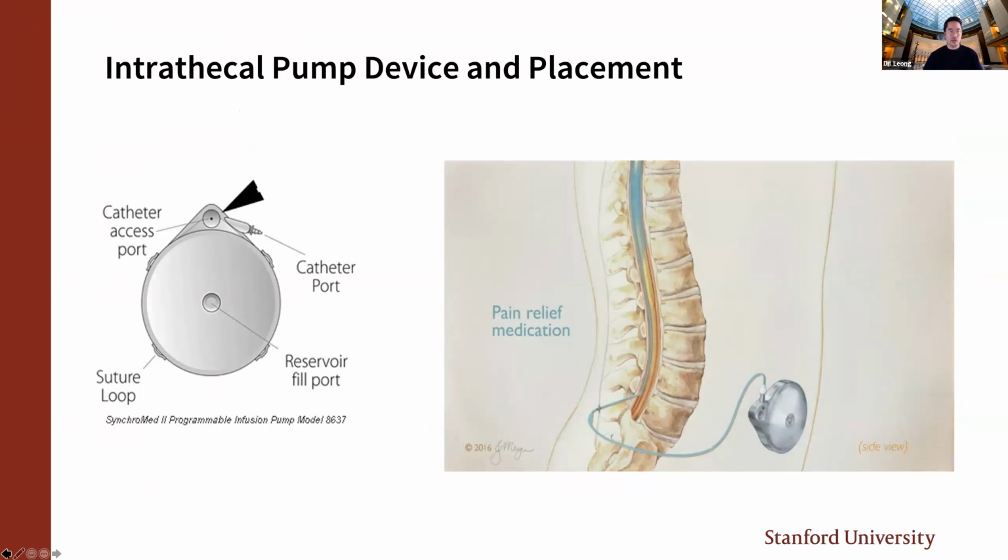The last thing to wrap this up is, where's the treatment for all over body pain, or pains that don't just occupy one nerve, or one nerve on the arm or up in the neck or any specific area? And this is really where intrathecal pump or intrathecal drug delivery systems come in, where we use targeted medicines in the spinal fluid in order to treat pain as an alternative to all the other kinds of oral and neurostimulation devices that have come before.